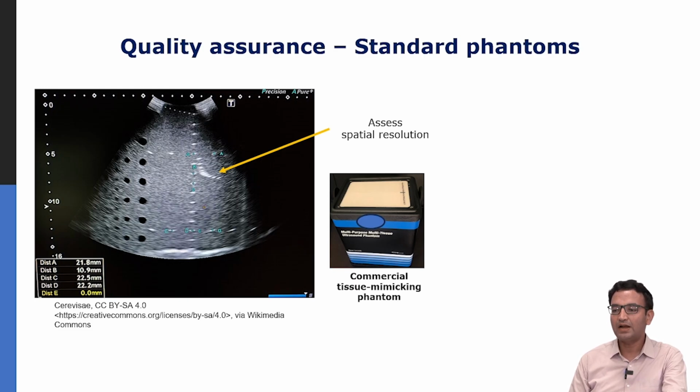And then we can look at the imaging performance by looking at the image. So for example, see here, as we go deeper and deeper, the points that are being imaged, so these are all points by the way, but they look like rice grain structures, and that is because of the anisotropic point spread function of ultrasound. So there is some spatial variation.